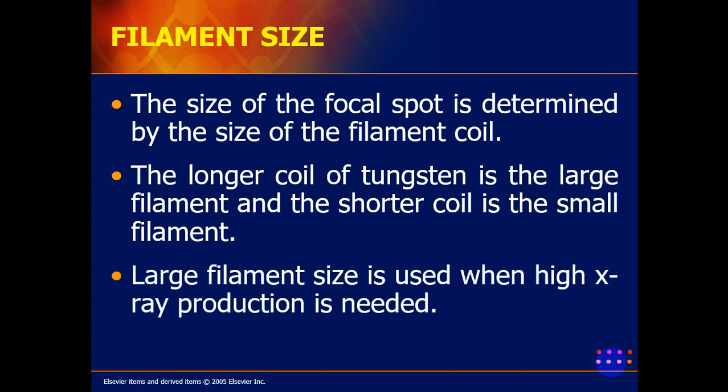The large filament size is used when high X-ray production is needed, like mag-X-ray ka ng vertebra, such as the lumbar, thoracic, kailangan mo ng large filament. Hindi pwedeng small filament. Pag kinakailangan mo naman ng detail, pwede na yan ang mga extremities. Kailangan mo ng detail niyan. At saka chest X-ray.